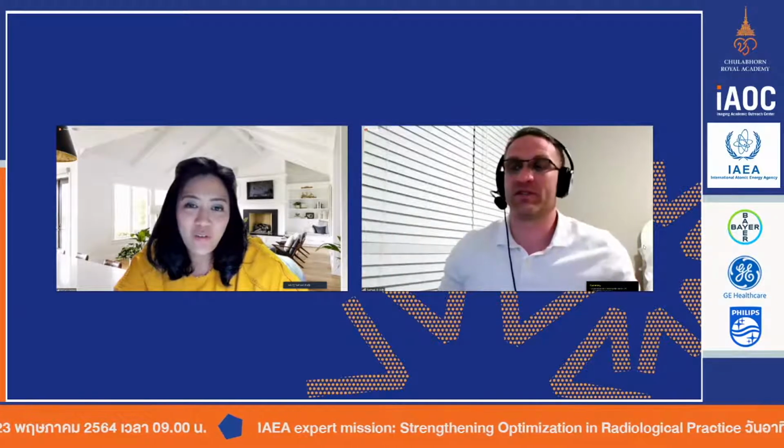Yeah, and this is true. So you guys have already done a round of DRLs, and we're talking about that in the next talk. The reality is that's just what you have to deal with. I guess the point of all of this, I hope you take away, is that the numbers you will now collect, now that you have all these different hospitals with their dose monitoring software collecting data from their mammogram systems, are going to be a mixed bag.